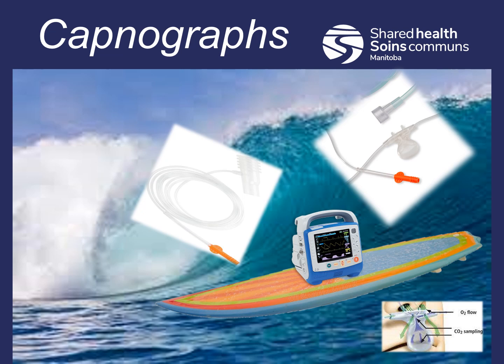So let's catch a waveform. Capnography is the ideal measurement we want to utilize. To obtain this measurement, we use capnographs. Not pictured is a mainstream capnograph that has a CO2 sensor in between the airway device and the breathing circuit. What we use are side stream capnographs.